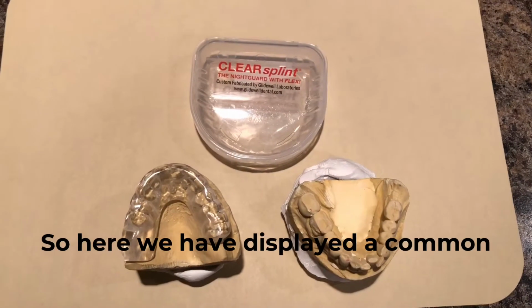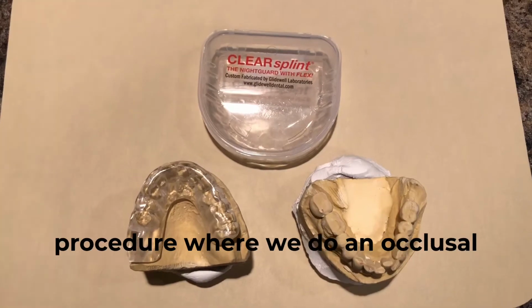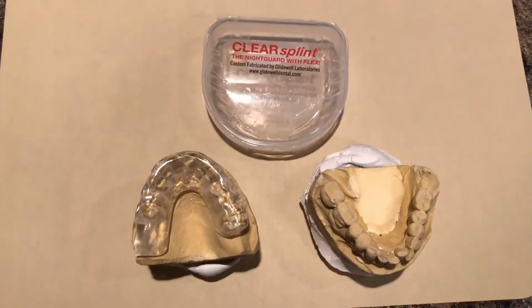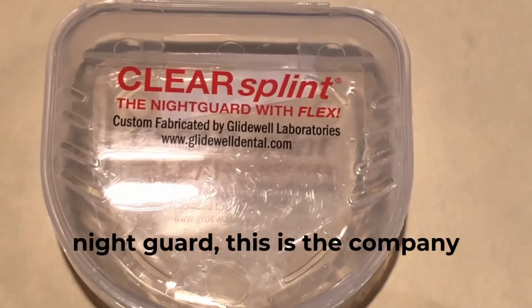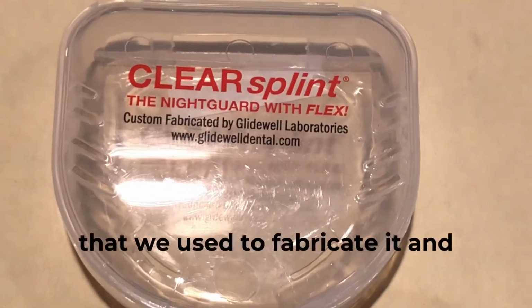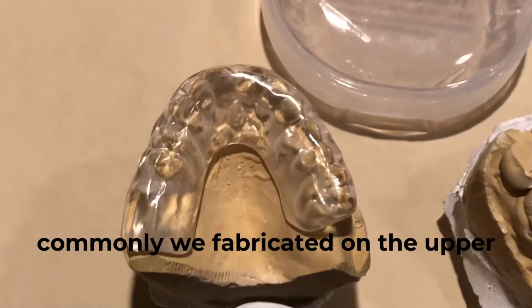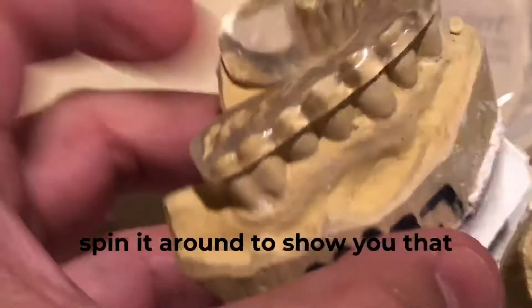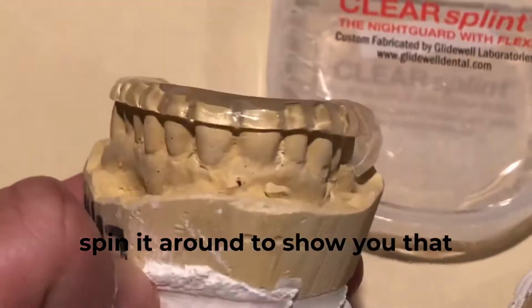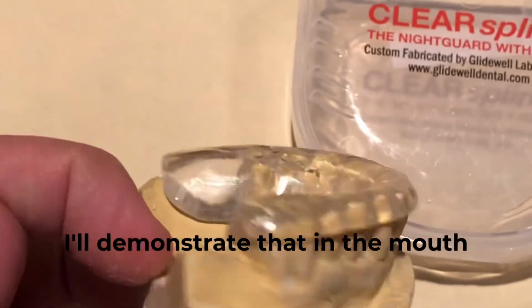So here we have displayed a common procedure where we do an occlusal guard, commonly referred to as a night guard, or a clear splint night guard. This is the company that we use to fabricate it. And commonly we fabricate it on the upper teeth. This is a model showing it on the upper teeth. I could spin it around and show you that it snaps on the upper teeth, and I'll demonstrate that in the mouth in a second.